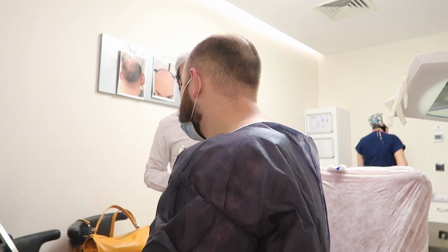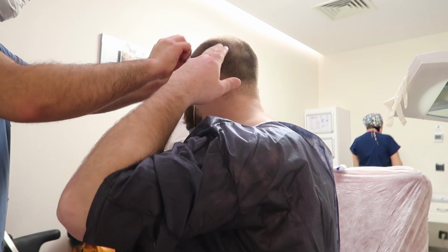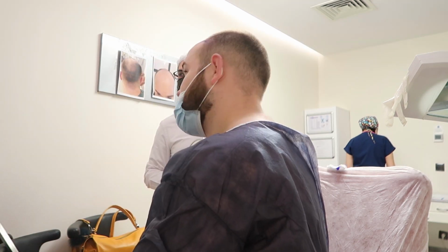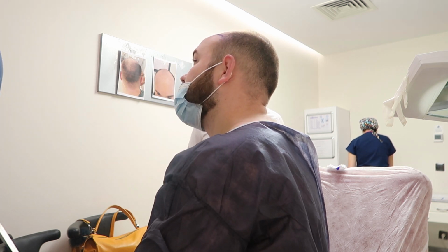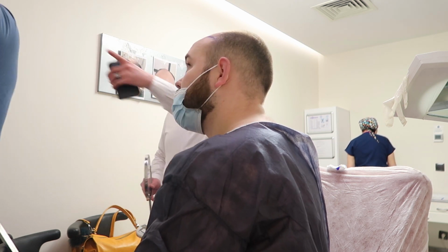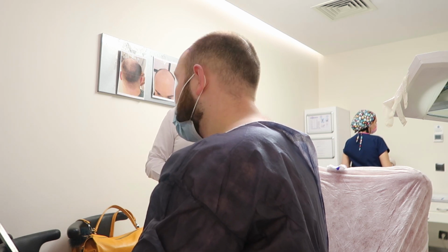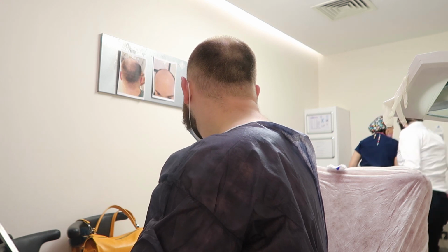So I know that he'll be taking donor area from back of your head, right? Yeah. From the back, right? That's all the donor area will be. From the back of your head till almost like your ears. Okay. And do we know roughly how many?